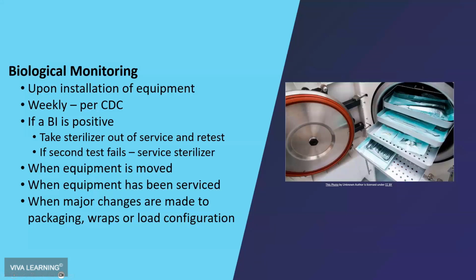If you move your sterilizer, say I'm moving it out from where it sits on the countertop to clean behind it, or I'm moving it to a different location in my sterilization area, it can throw things off. It can affect the mechanical function of the sterilizer. So if that happens, then you must again recalibrate and do 3 consecutive biological indicator or spore tests before it's used. And they, of course, all have to be negative or passing.